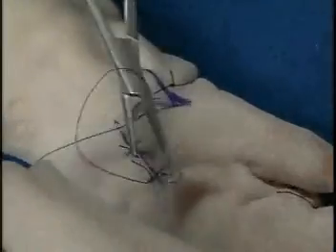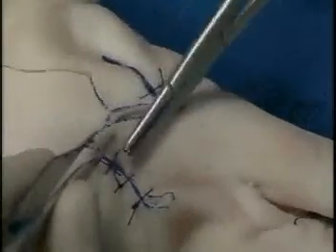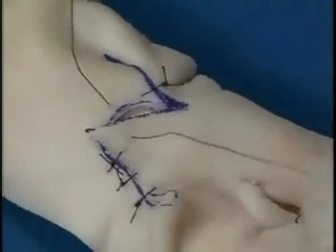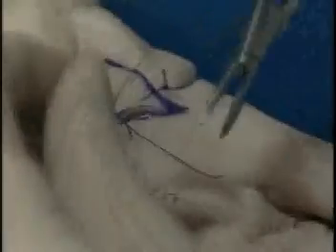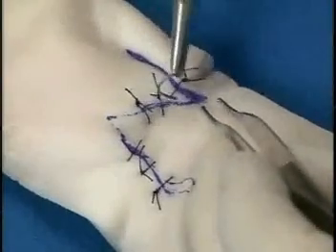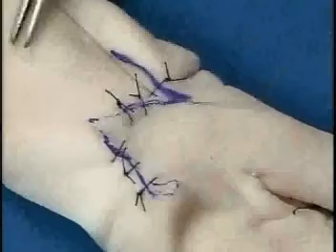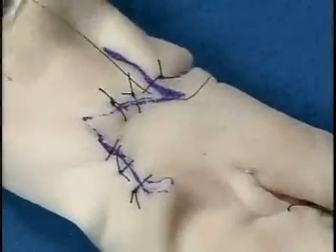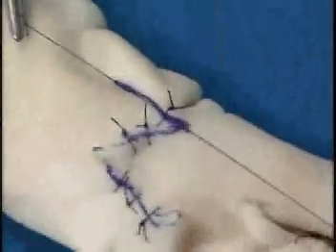Here we're now closing the remainder of the flap. You can see there's a triangular excess which will need to be trimmed and inset properly. And again, another suture is placed at the apex of the tissue so that all limbs of the defect are closed. The remainder of the tissues are closed according to the principles of halving.